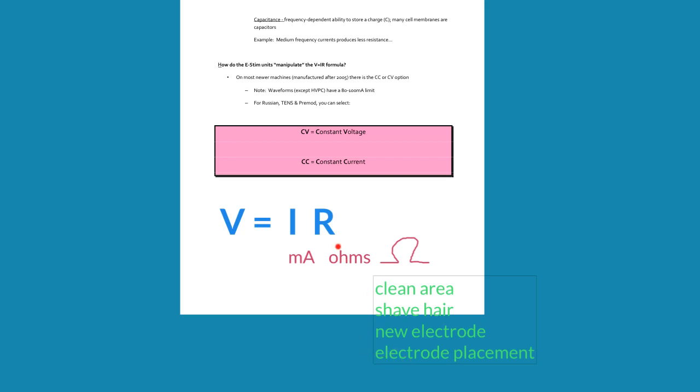Another big part of how we can reduce the ohms is to experiment with the electrode placement. We know that bone is a relatively good insulator. So if you have part of the electrode over a bony landmark, this can be really common at the shoulder when you're trying to place it, especially if you're doing interferential around the shoulder. You have to really be careful to avoid certain bony prominences of the scapula or the AC joint or other superficial areas. At the ankle, this is also tricky because you have a lot of superficial bones and not necessarily a lot of good muscle connectivity at the ankle.